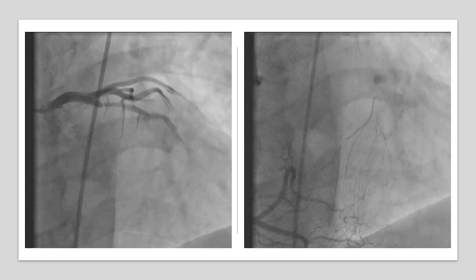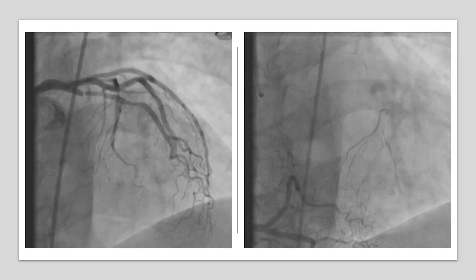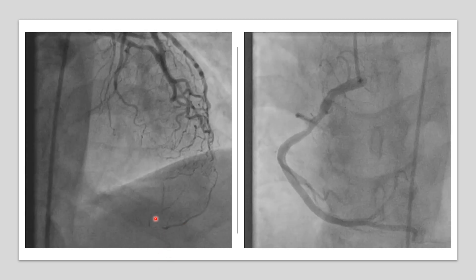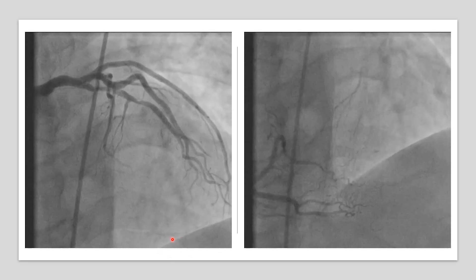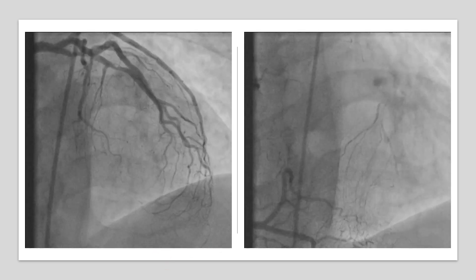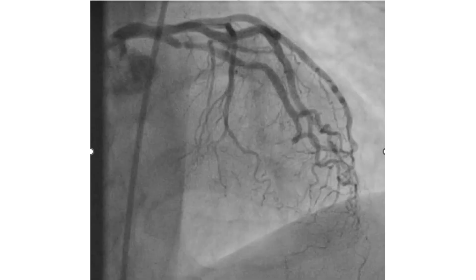Also, in the antegrade injection, there is some visualization near the apex. So this is the course of the LAD starting here with subtotal occlusion — this is the proximal LAD — and it ends up with a large diagonal. But the actual course of the LAD is here.